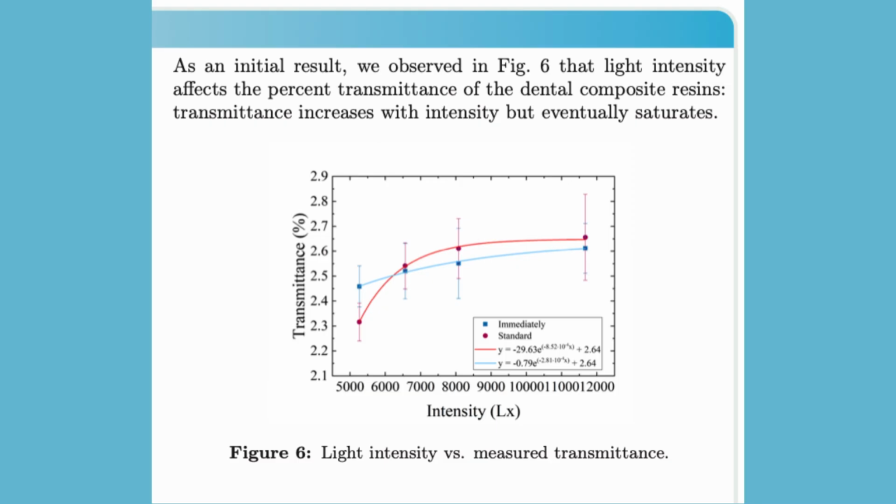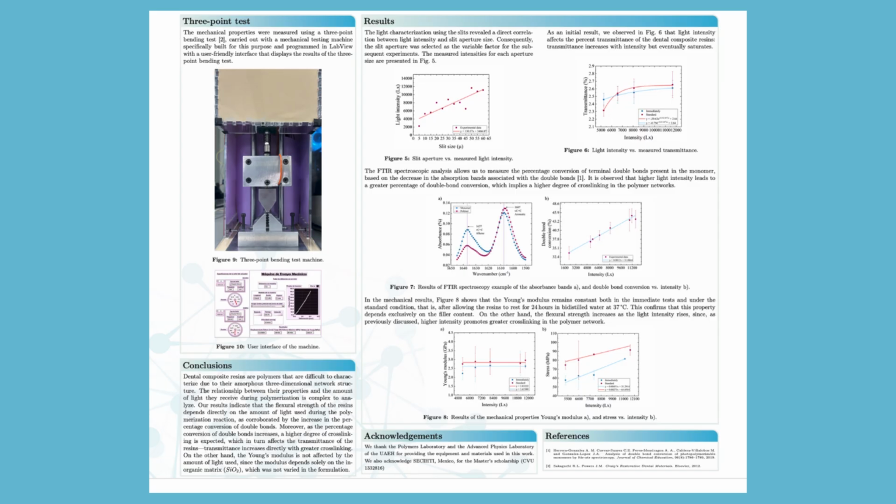On the other hand, we can see an increase in the percentage of light transmittance. Nevertheless, the material eventually saturates. These tests were conducted immediately after the samples photopolymerized and then 24 hours under standard conditions.